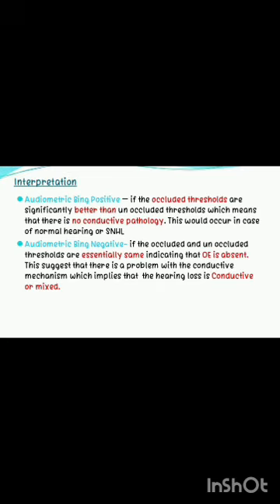Audiometric Bing negative if the occluded and unoccluded thresholds are essentially the same, indicating that the occlusion effect is absent. This suggests that there is a problem with the conductive mechanism, which implies that the hearing loss is conductive or mixed.